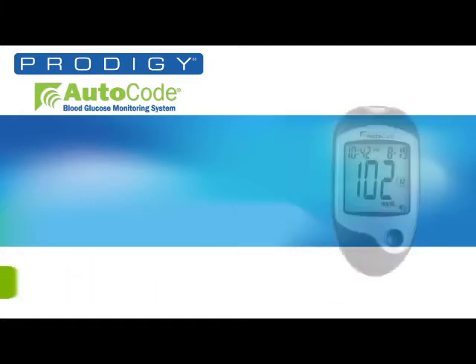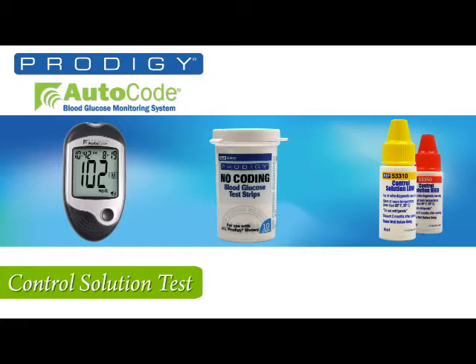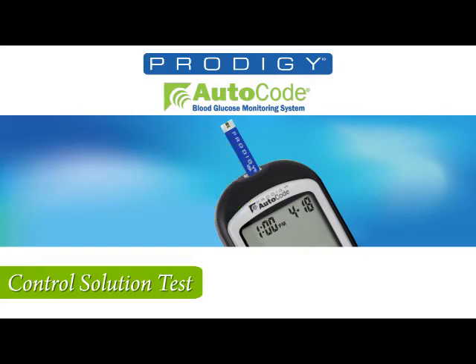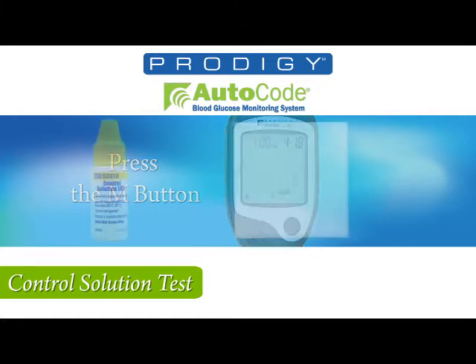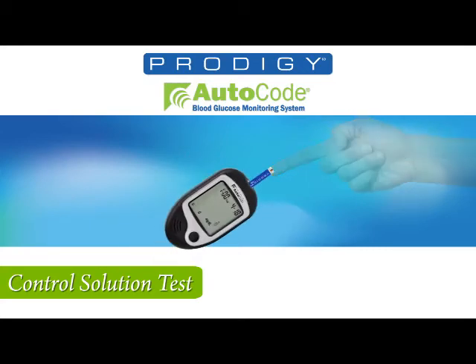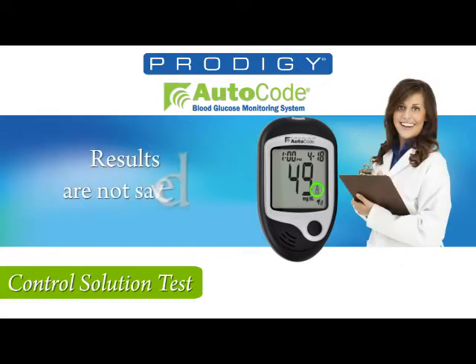You will need the following to perform a control solution test: the Prodigy Auto-Code Meter, Prodigy No-Coding Test Strips, Prodigy Control Solution, and tissue. Remember, only use Prodigy Control Solution and Prodigy Test Strips with the meter. First, insert a test strip into the test strip slot. Now press the M button and the control solution mode will be entered. Shake the bottle and discard the first drop on your tissue. The second drop is applied to your finger and then applied to the test strip. The meter will count down and report the test results. Now you can check the control solution ranges on your test strip vial. Remember, in the control solution mode, the results are not saved.